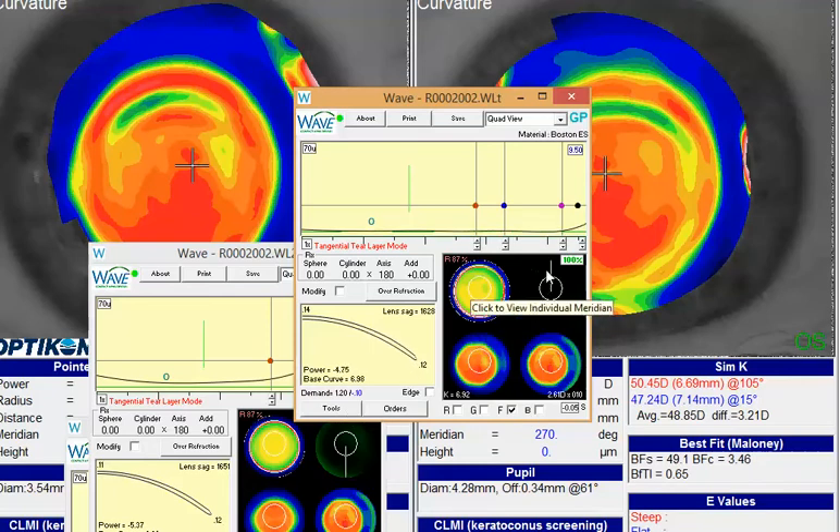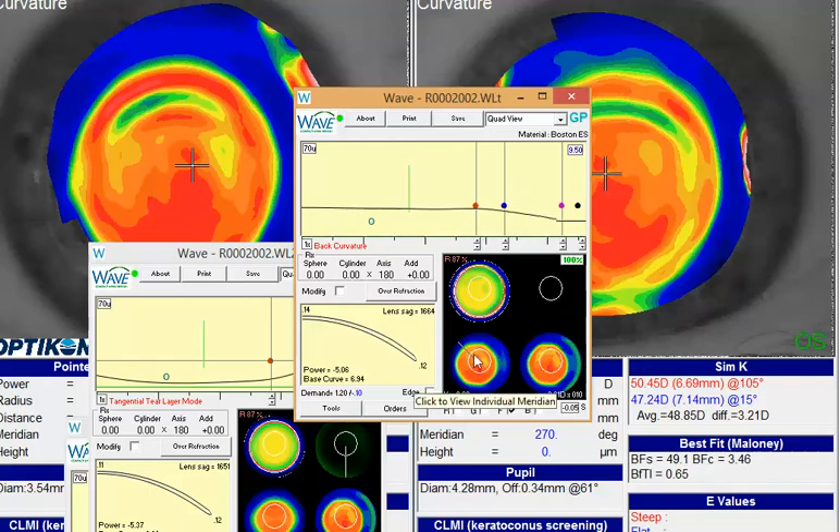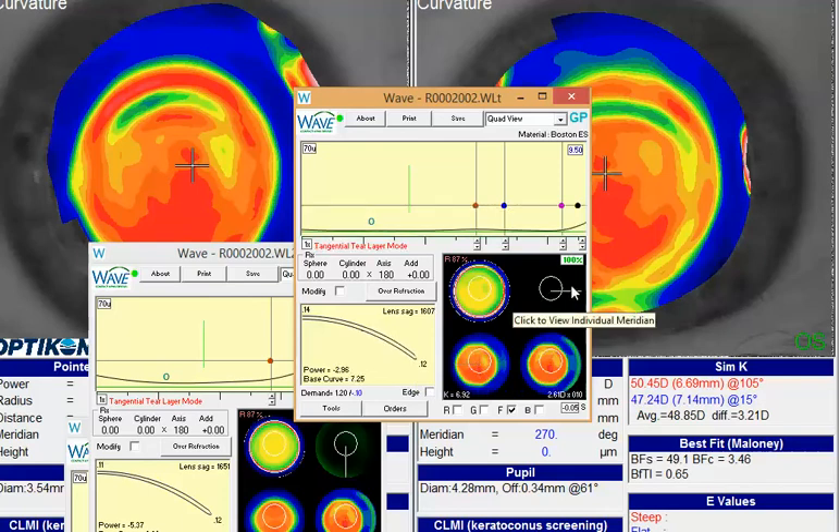Now what you'll notice is all the radials are pretty even right around the clock dial. In this particular case, I also added in a little bit of S-factor. The aspheric component in this will sometimes help that lens take a nice easy contour across the cornea, keeping a nice back surface lens profile as seen in that lower left quadrant of the quad view. Now you don't have any of those downturns and uplifting areas like you had in your original design, so I would anticipate this lens to sit more evenly around the cornea.